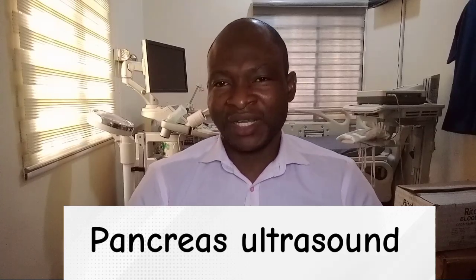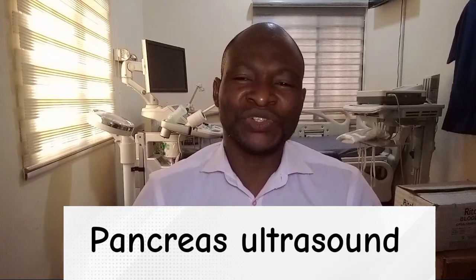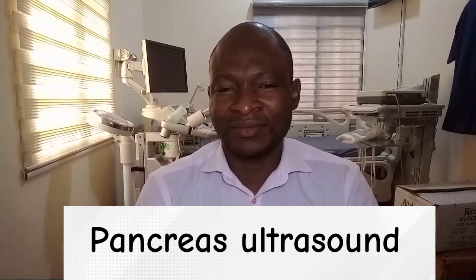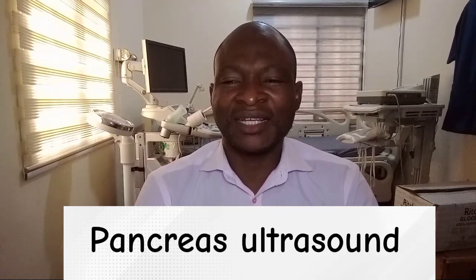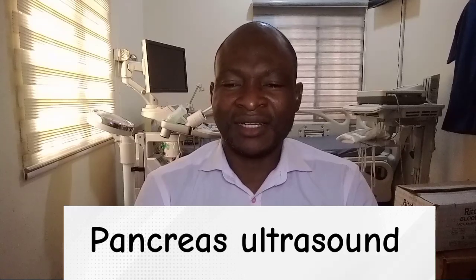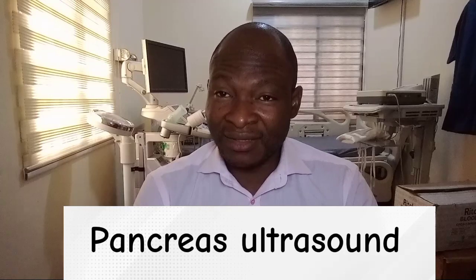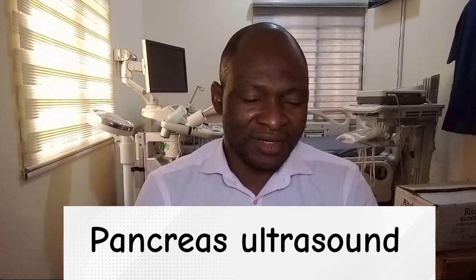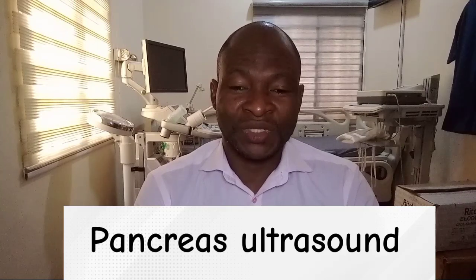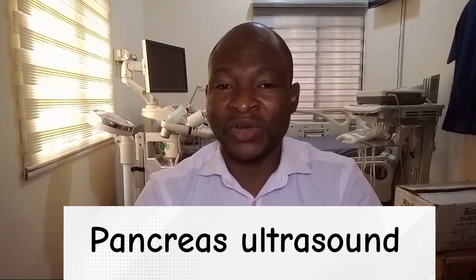Alright, sonographic appearance of a normal pancreas. I haven't understood the anatomy. The pancreatic parenchyma has a homogeneous texture, but coarser than that of the liver. Its echogenicity is slightly greater than that of the liver, of course. The size and echogenicity of the pancreas varies with age and obesity. The pancreas normally atrophies with age, so the size gradually will decrease as the individual is aging.